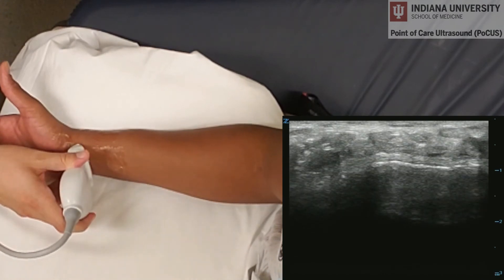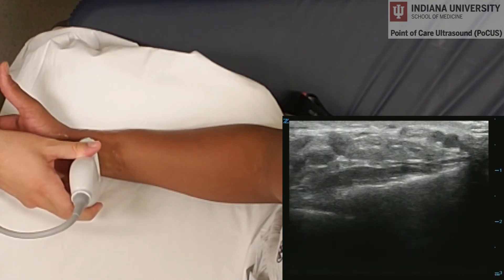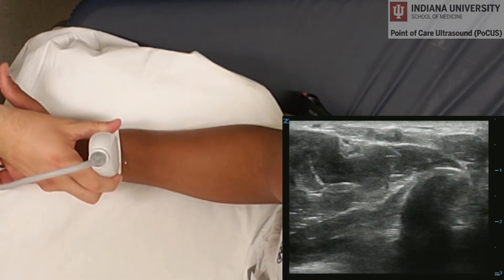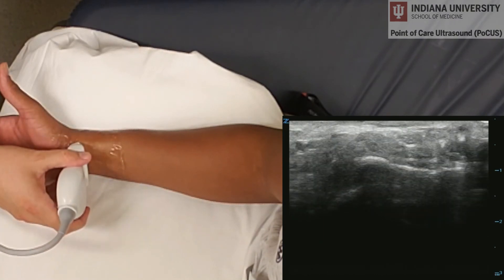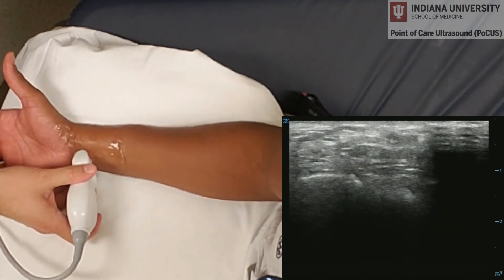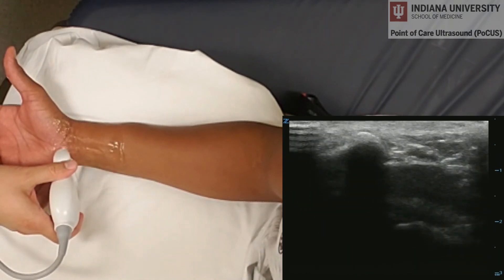We can also evaluate the radius on the volar side, going both proximal and distal, looking for any signs of cortical disruption which would indicate a radial fracture. We can also evaluate the ulna in the same fashion, both proximal and distal, looking for any signs of disruption.